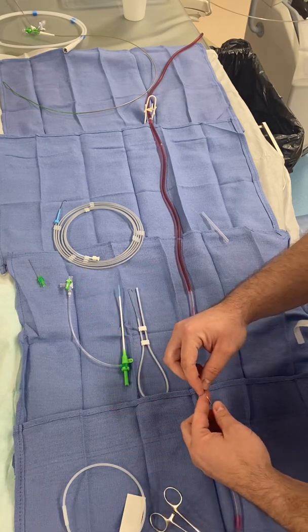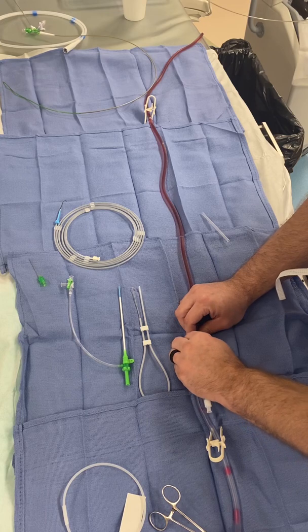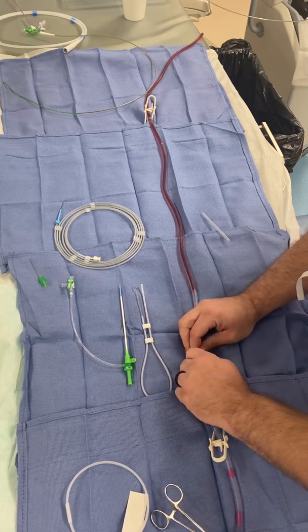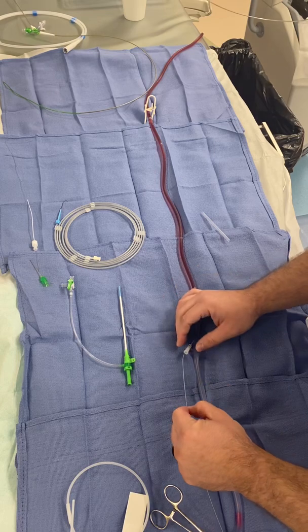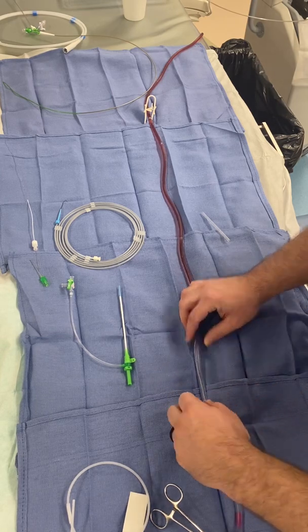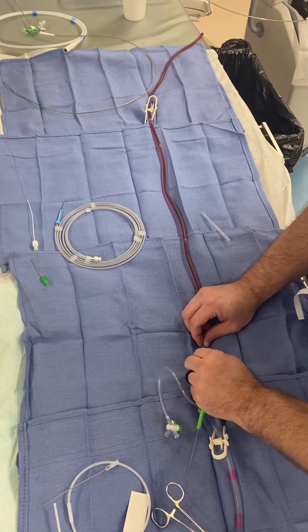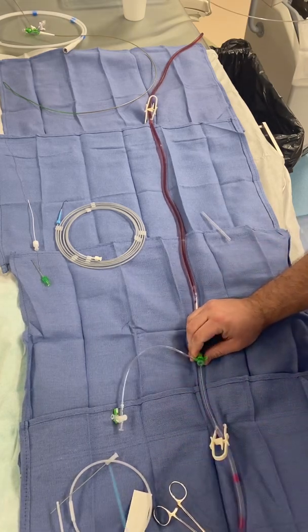This is just a four French micro puncture to dilate up. Wire out — that's just the wire that comes with the Pinnacle. Then a transition sheath, going in with the six French Pinnacle. Sheath is up, wire is out.